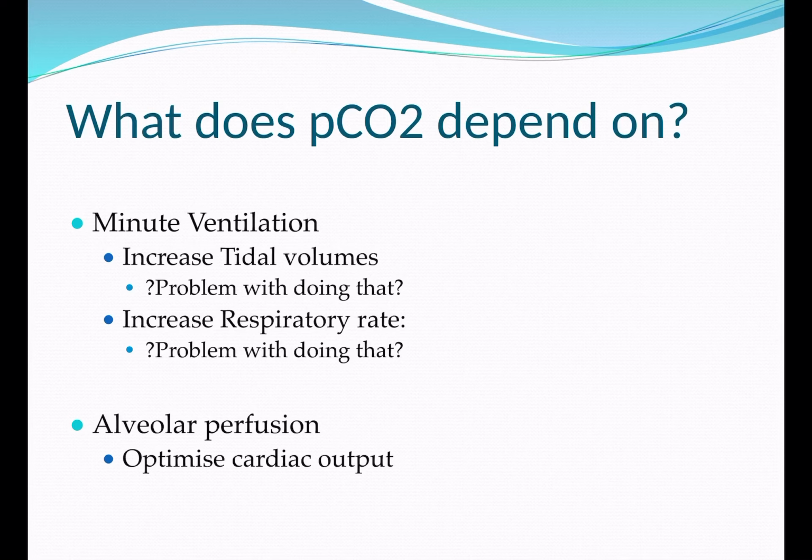And if you increase your pressure, again, you can cause damage to the alveoli, something called barotrauma, where if you've got lots of pressure that the alveoli sees, similar to that of a balloon, they can pop or they can tear open. If they do that, then that again can cause inflammation and potentially pneumothoraces.